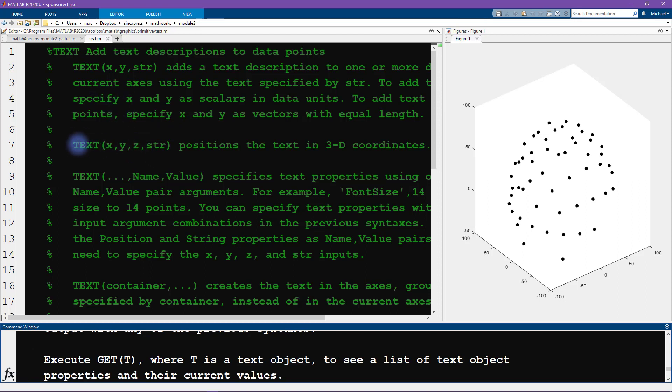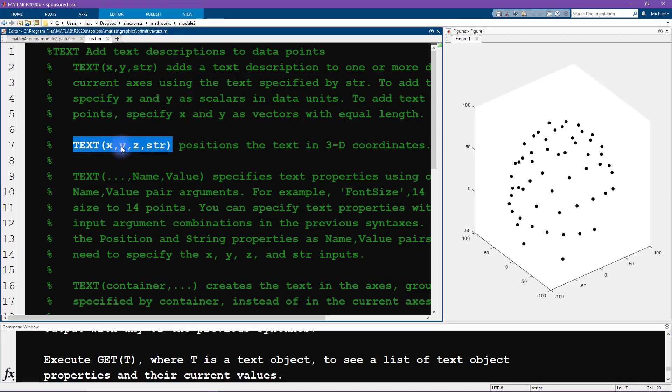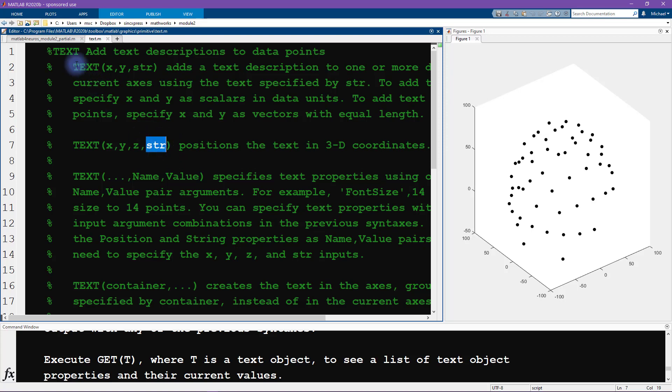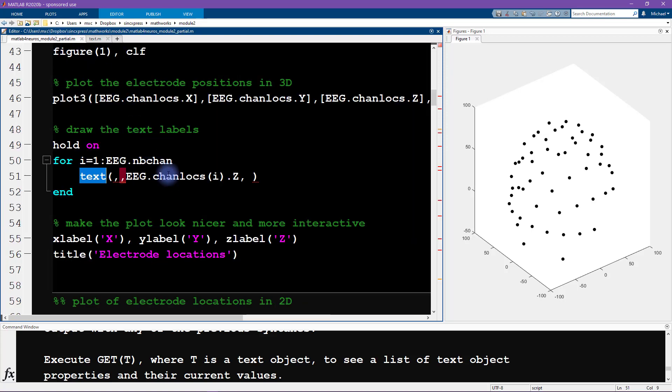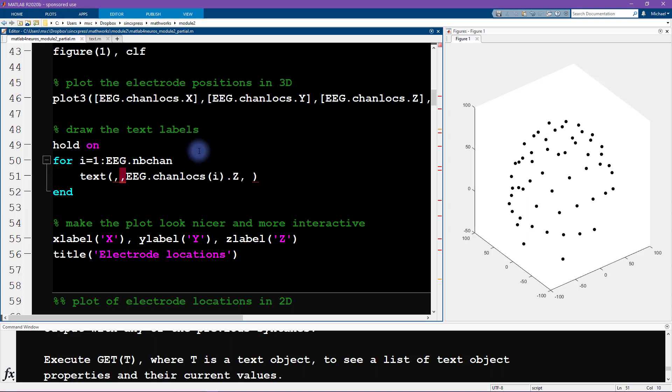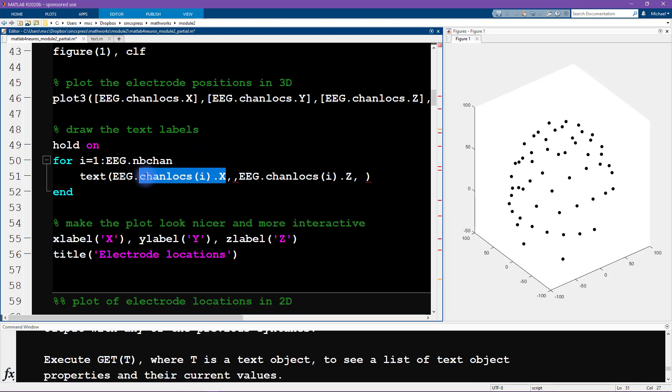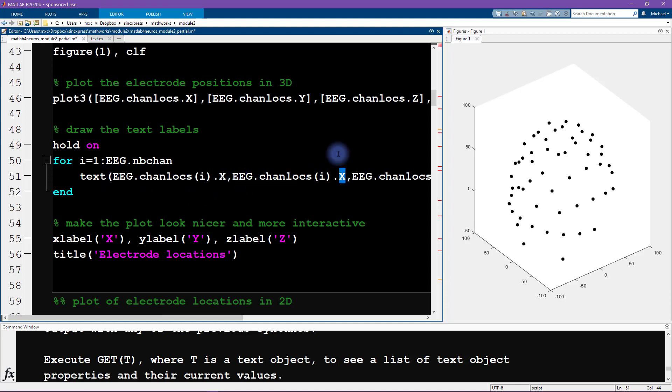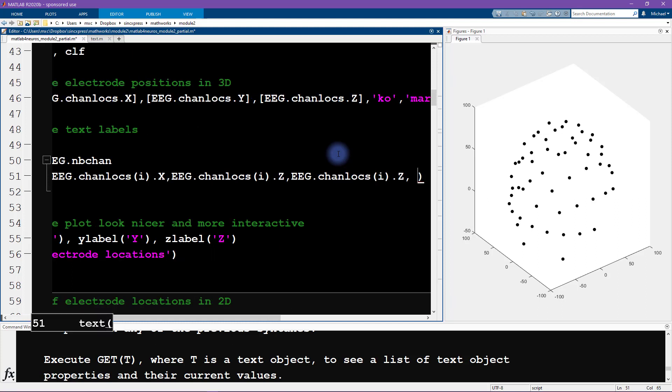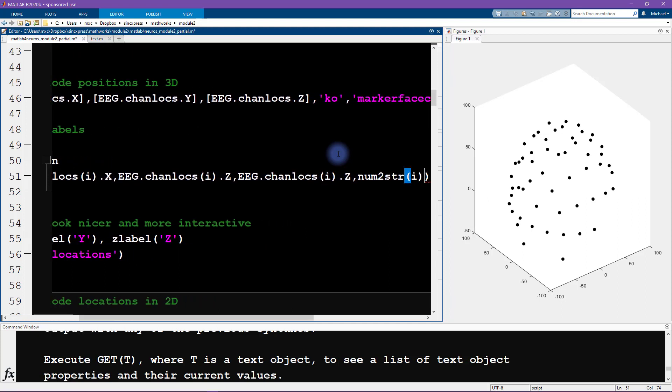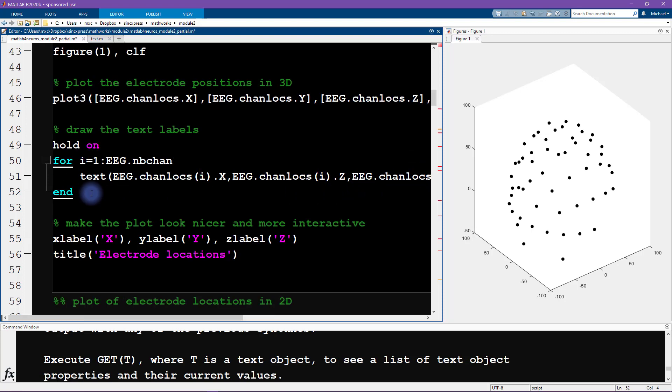So here's what we're looking for: text, x, y, z, and string. We need to input the x, y, z locations. And then the fourth input is going to be the string that we want to make a text of. So we have inside a for loop. We're looping over channels, and we write EEG.chanlocs(i), so we want the i-th element of the chanlocs structure array. And then we want the x location. We get the y location. And then I will just say num2str. This is a function that converts the number into a string. I'm just going to be plotting the channel index here.